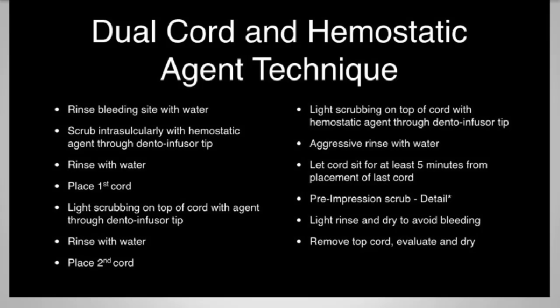We then aggressively scrub hemostatic solution into the sulcus through a dental infuser tip. This solution is then aggressively rinsed off, again with water and air. And if we see any bleeding there, once again we apply hemostatic solution. The reason we aggressively rinse with air and water is, if we get bleeding with air and water, we're definitely going to get bleeding with impression material. So we want to make sure things are under control.